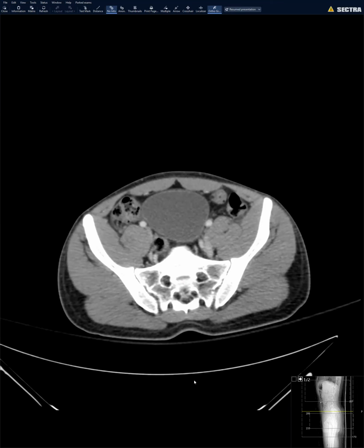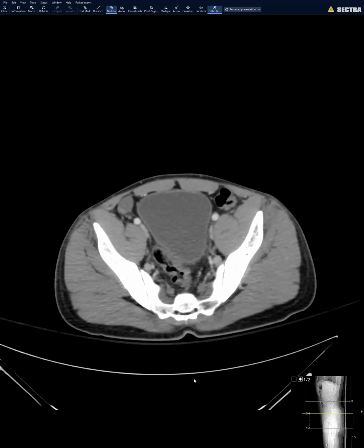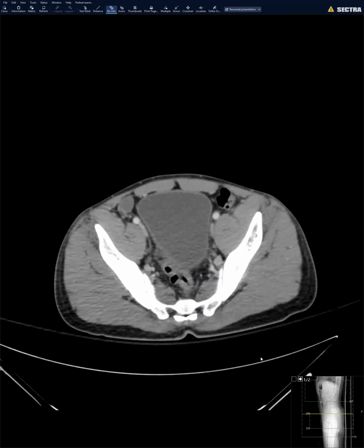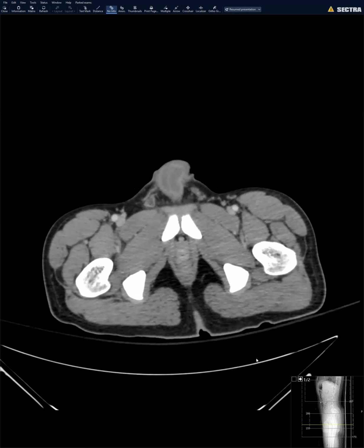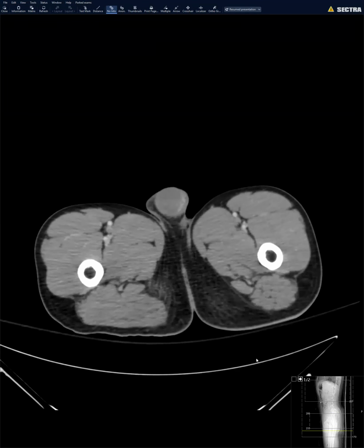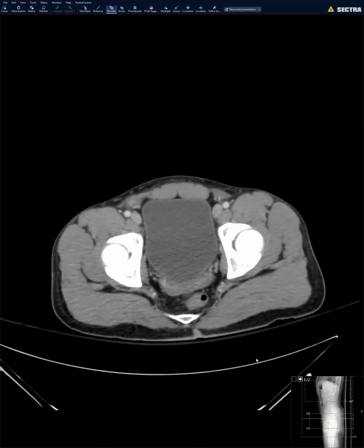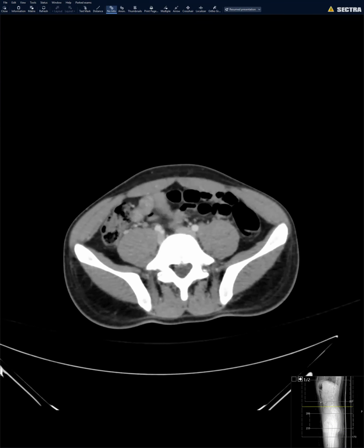Okay, so this patient came in with history of right groin swelling. He was thought to have right inguinal hernia, which they quote reduced in the ED. But soon after they reduced the hernia, he had 2 episodes of severe bradycardia. He bradyed down to the 30s, nausea, vomiting. So then they decided to get imaging on him.